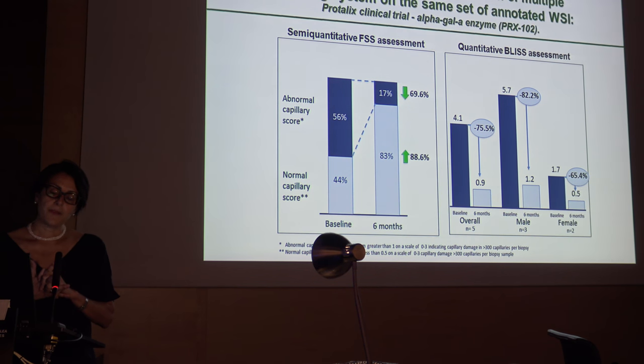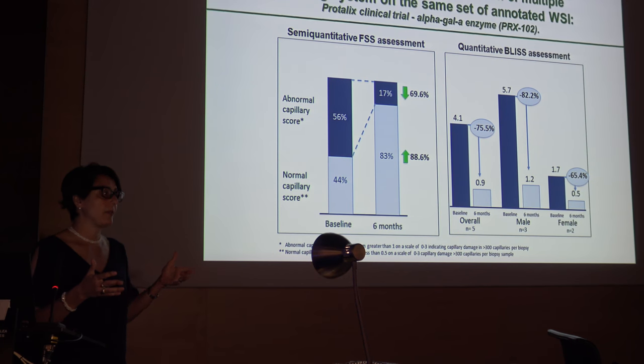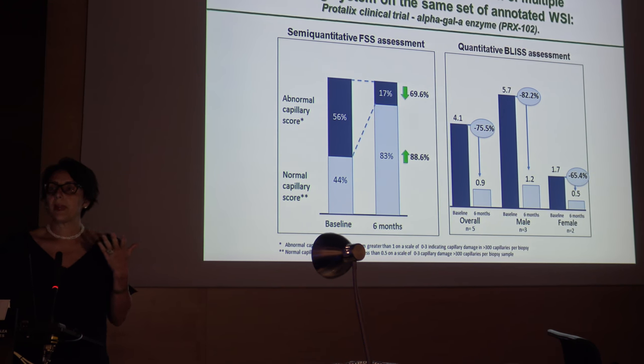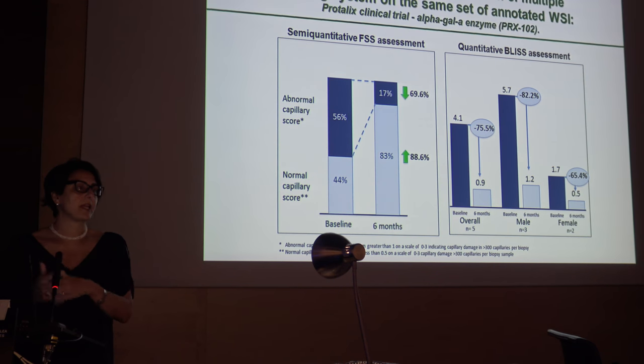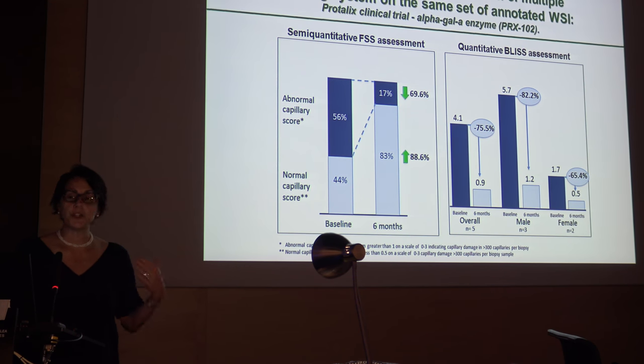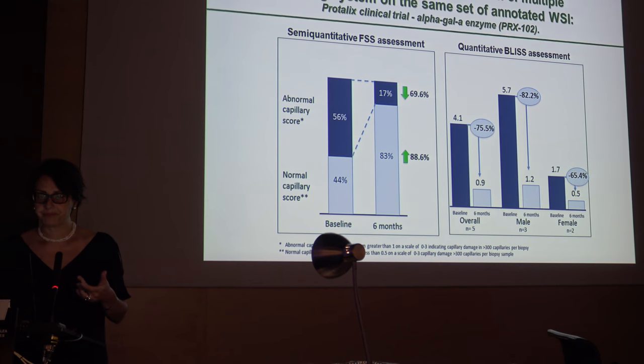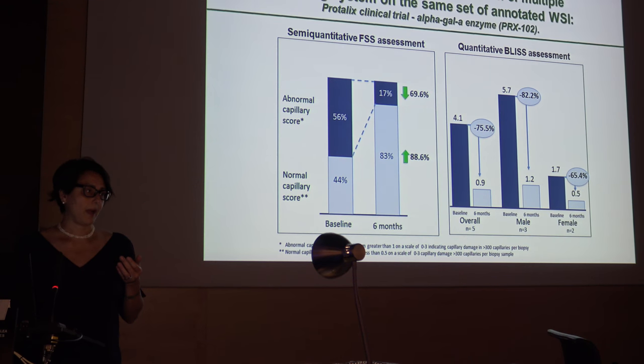And another thing that I think needs to be pointed out: if you think about these clinical trials and you're looking at 300 interstitial capillaries, and now you have a discrepancy between the two pathologists, you need to have an adjudication. So normally, the third pathologist, the adjudicator, will have to rescore all 300 capillaries to come up with some adjudication. But now, because the capillaries are enumerated and marked, the adjudication can occur only on the subset of capillaries where there is a discrepancy. So it really improves the workflow for everybody. And doing these studies, Charles, myself, and Bob Coleman annotated and scored over 54,000 capillaries.